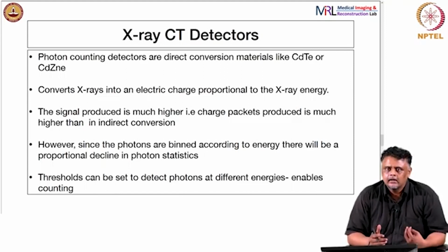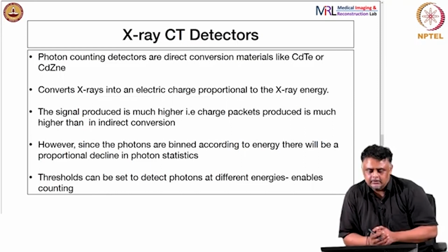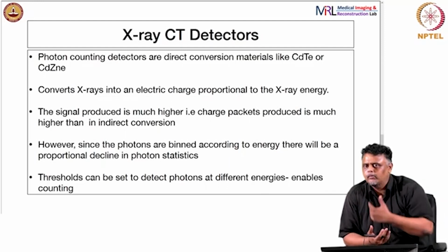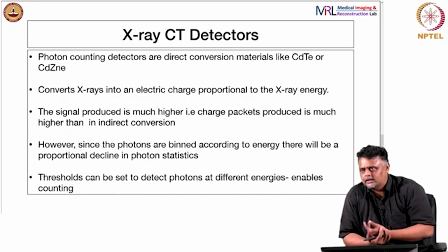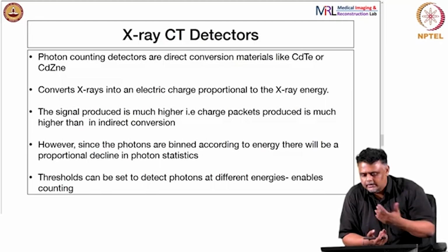You saw that mu, the attenuation coefficient, describes the X-ray interaction with tissue. If it is mostly water, then there is not too much of a density difference, so the mu is not too different, except again maybe bones. You can see that bones are very clearly shown in projection radiographs also, because they have a much higher atomic number. But these kinds of detectors help you to get better contrast. So, you can reconstruct multiple energies and try to figure out different types of tissue, like maybe cancers become very obvious early on if you use this kind of imaging. But again, this is work in progress.